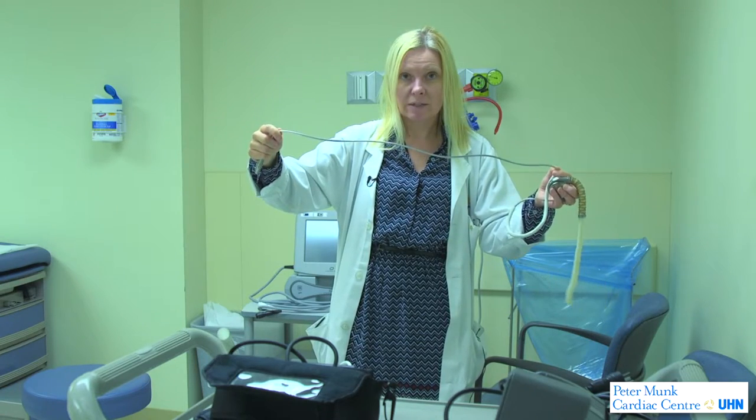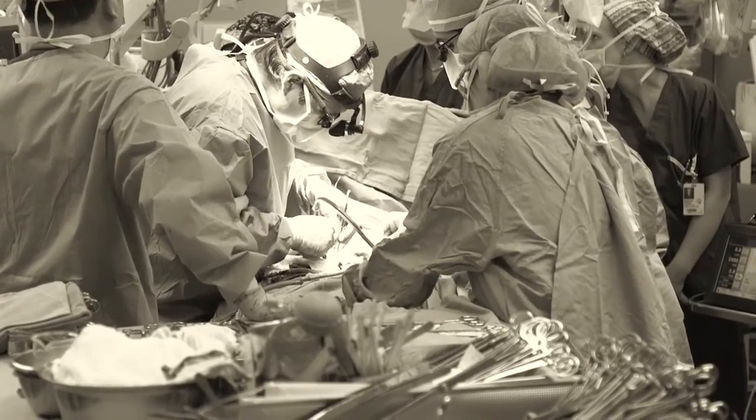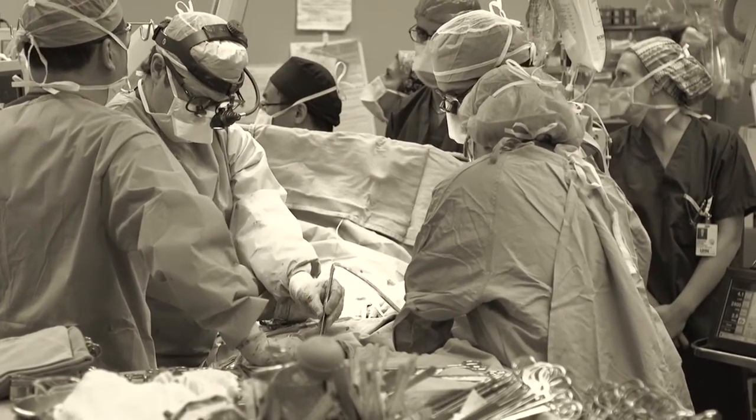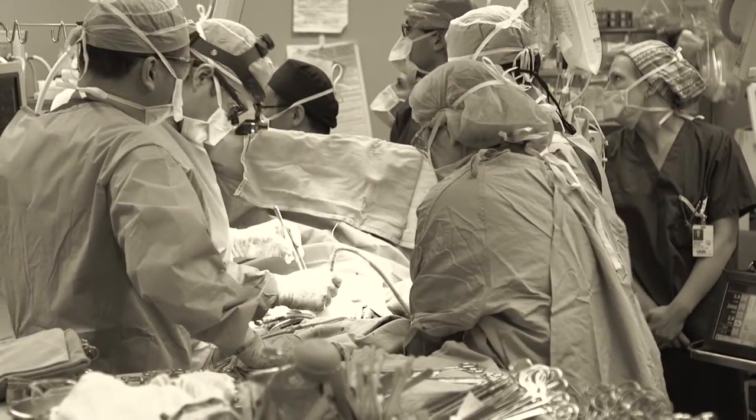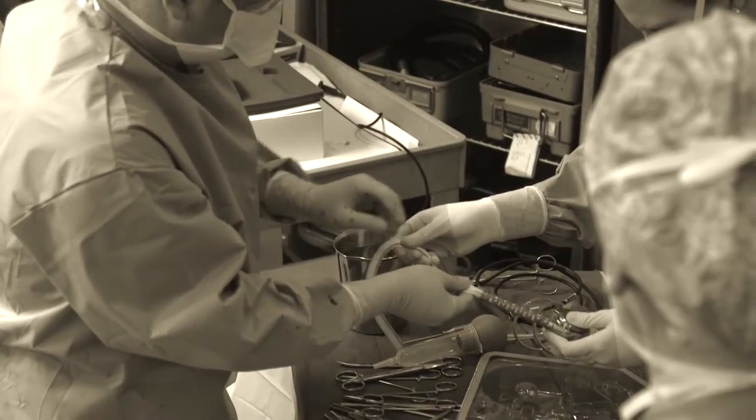You'll notice with both pumps they have what we call a power line or drive line. This is the only thing that the patient will see coming out of their body. The surgeon will make a small incision in the abdomen just about the waistline, and this line will come through either on the left side or the right side.